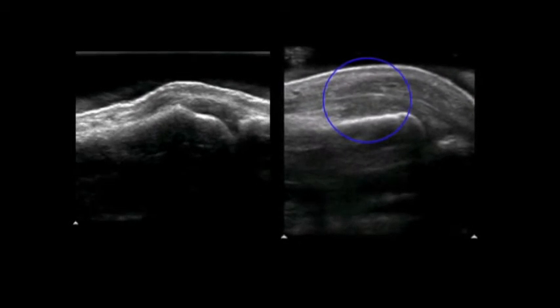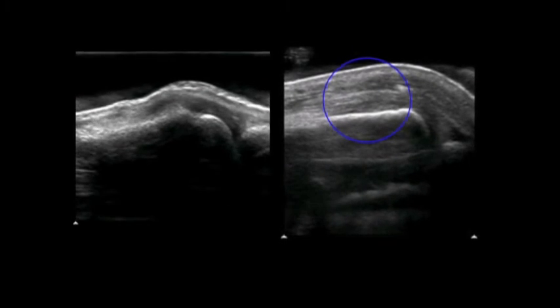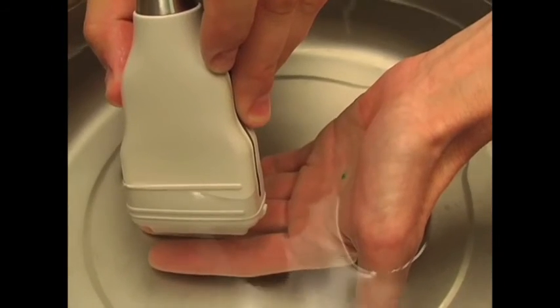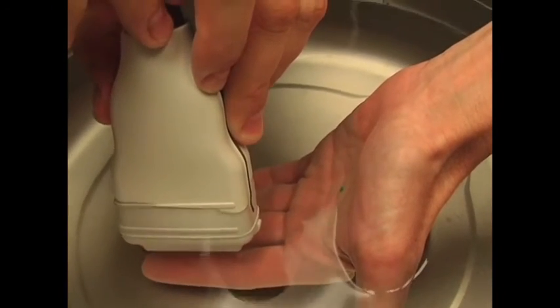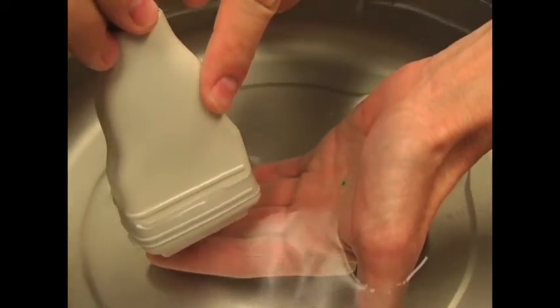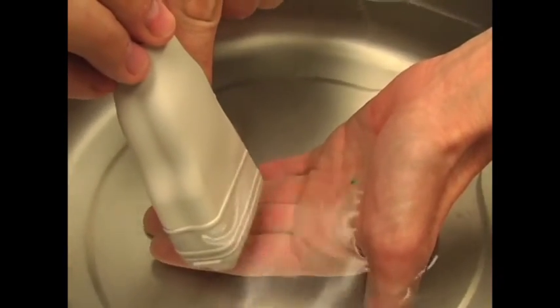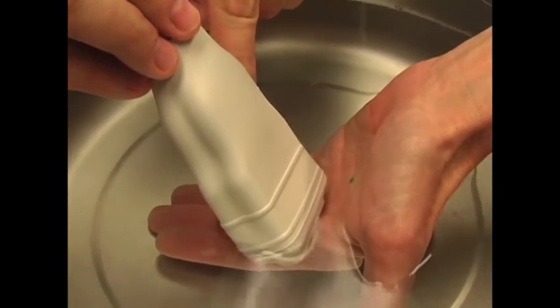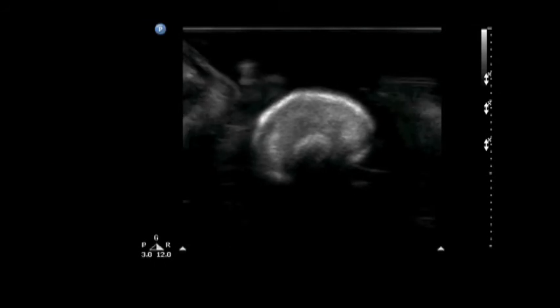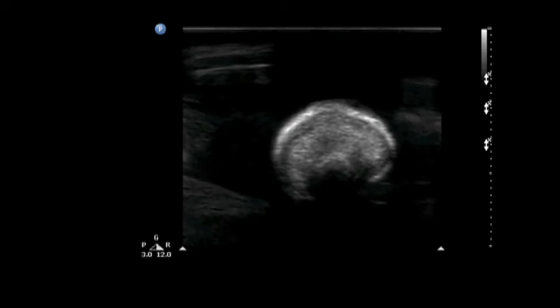On the right side of the screen is an extensor tendon sliding across the MCP joint with an impaled foreign body. Back to our finger in the water bath. To inspect it in short axis, turn the transducer so that the indicator is towards the patient's right, and the right side of the finger is on the left side of the screen. To make sure the orientation is correct, put your finger into the water on the indicator side of the transducer and watch it appear on the left side of the screen.